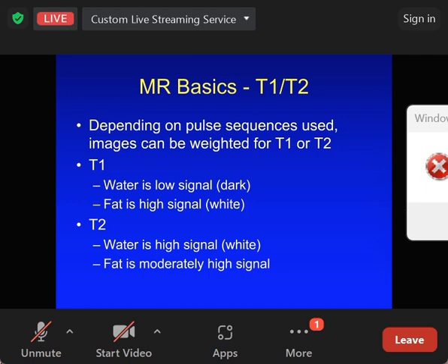So for routine MR imaging, we use the resonance of protons, that's hydrogen atoms, and they are rotating at a particular speed for a 1.5 Tesla magnet. That's the strength of the magnet, and most MR systems are 1.5 Tesla. We have a frequency of, I think, about 67 megahertz. Those of you who know about radios will know that FM radio is transmitted on 88 to 108 megahertz. So it's just below the frequency of FM radio.